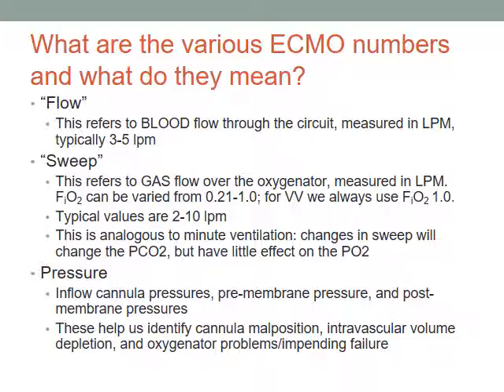Sweep is a term that we use for gas flow over the oxygenator. So if I say, what's the flow? There's obviously potential for confusion. Am I talking about the gas flow? Am I talking about the circuit flow? Probably best if I clarified what I meant, but the term sweep refers to the gas flow. That's also in liters per minute. And the sweep gas can be whatever gas one wants to use, but we use oxygen.